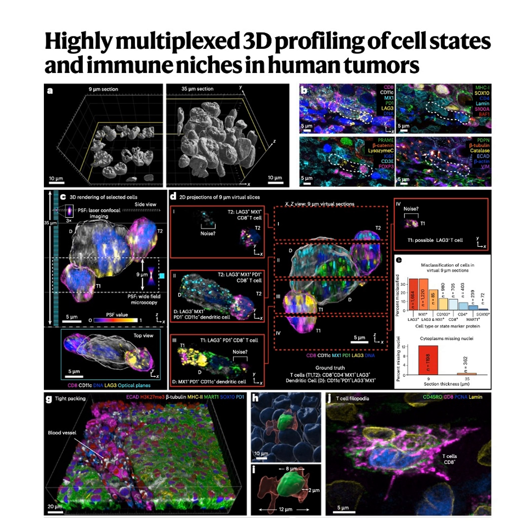You stain for maybe 3 or 4 markers. You take detailed images of them, noting their location. Then, and this is the clever part, you use chemicals to basically bleach or inactivate the fluorescent tags on those first antibodies, making them invisible. Then you come in with the next set of antibodies for different markers, stain, image again, and you repeat this cycle, stain, image, strip, until you've measured all the proteins you're interested in, building up a highly multiplexed map.